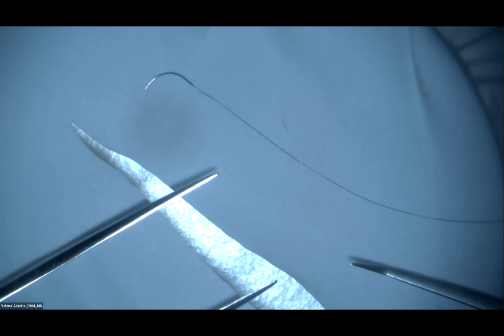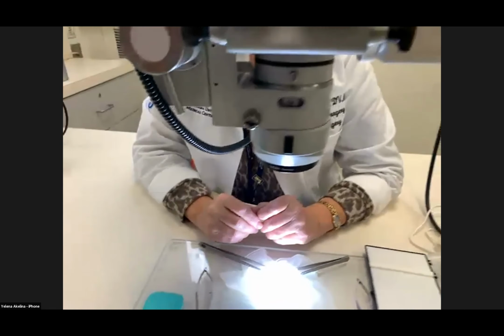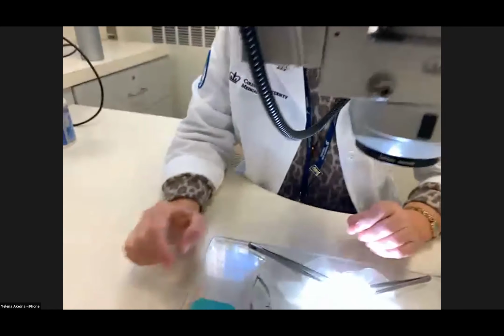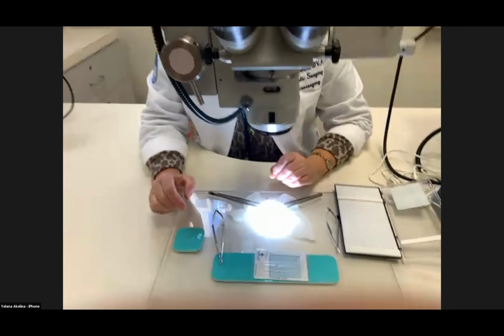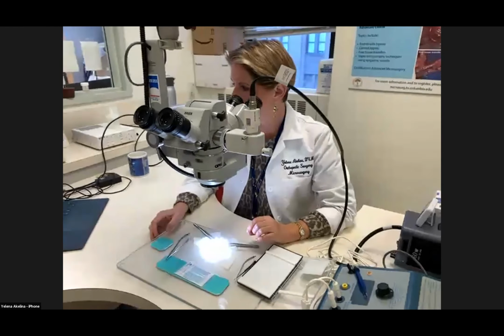We can make it a little central. The white part is out of focus.